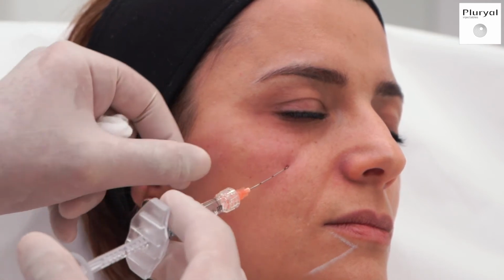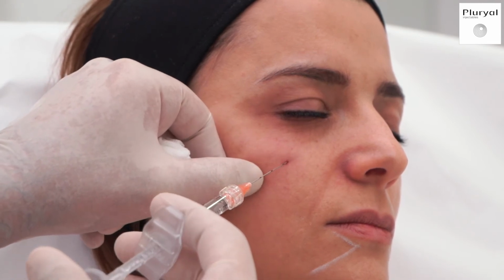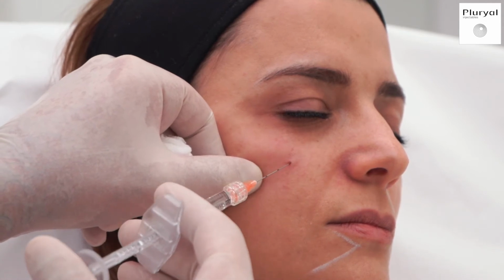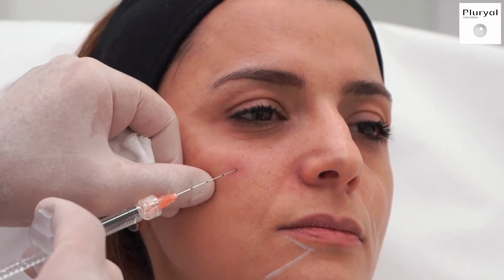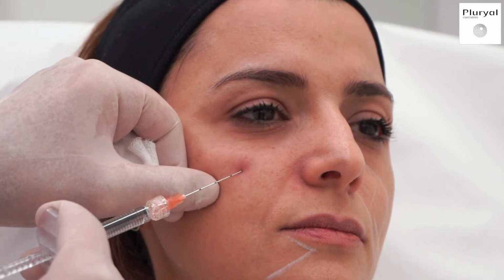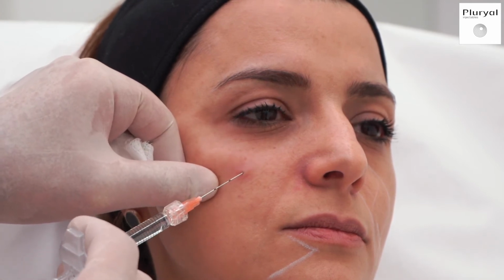I go deep, and I like to inject small boluses on the way just to anesthetize this area so the patient doesn't feel any pain. When I introduce my cannula, I give small boluses just for the anesthesia so that the patient would be comfortable.